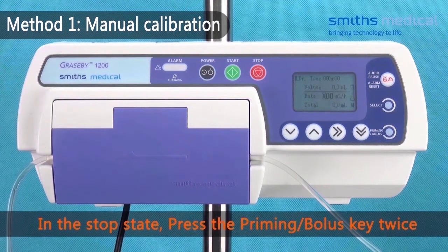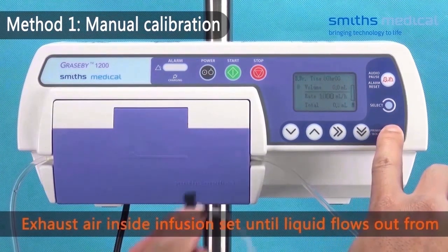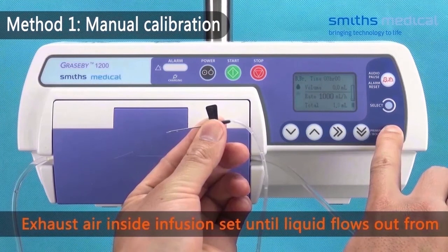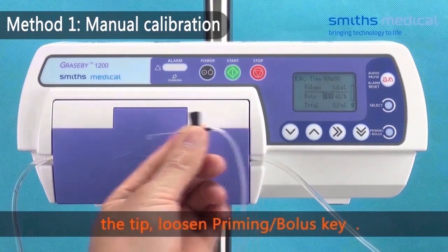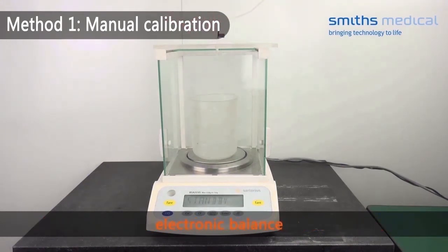In the stop state, press the priming bolus key twice, continuously and hold. Expel air inside the infusion set until liquid flows out from the tip. Loosen the priming bolus key. Place the syringe needle of the infusion set on the beaker of the electronic balance.